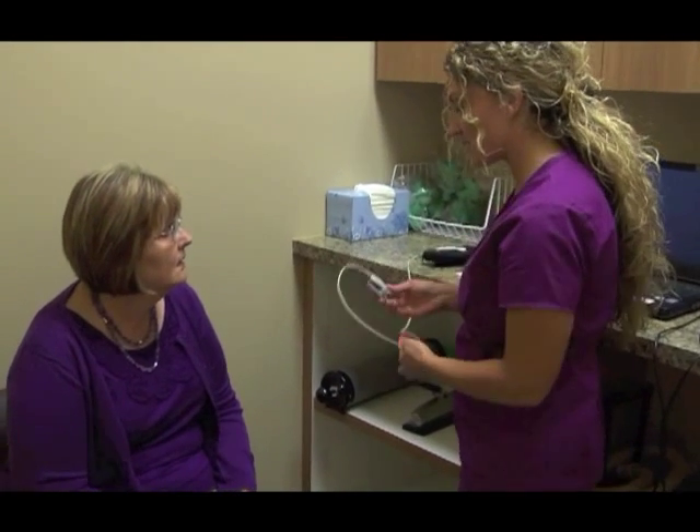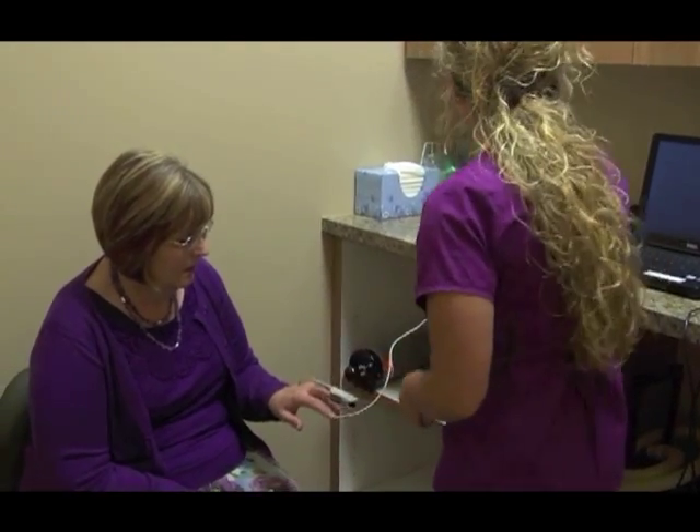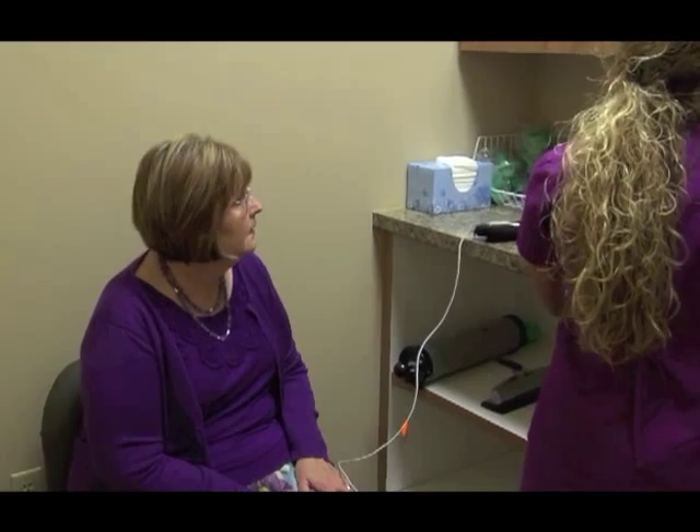We're going to go ahead and do a spirometry test on you. We're going to start by getting your oxygen level — pointer finger, middle finger, okay? I'm going to go ahead and bring up your chart.